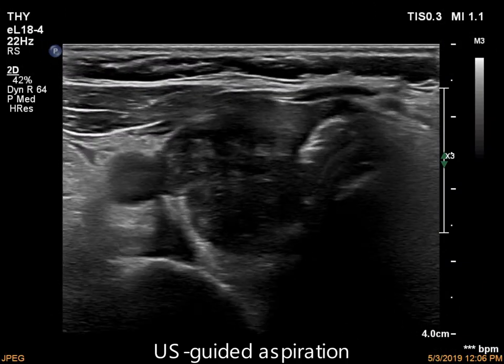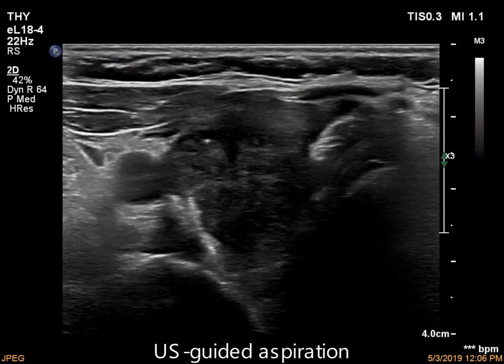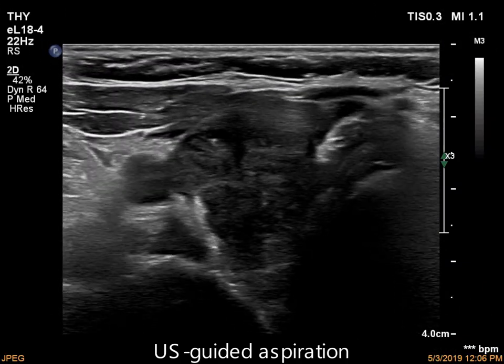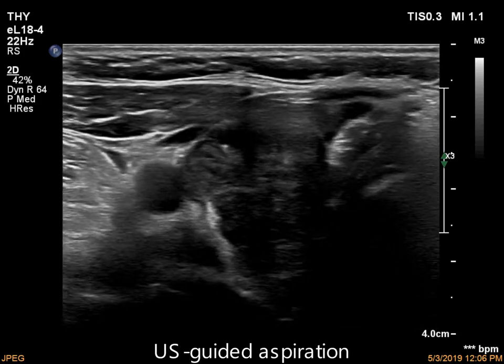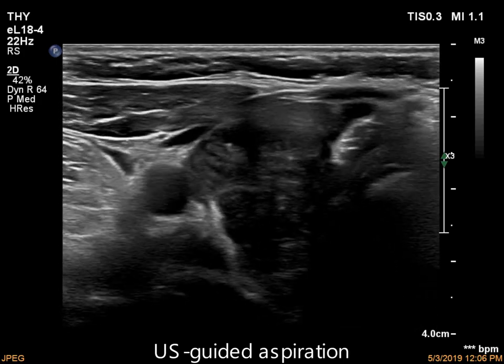The large nodule has at least one microcalcification. The tip of the needle is easy to identify.